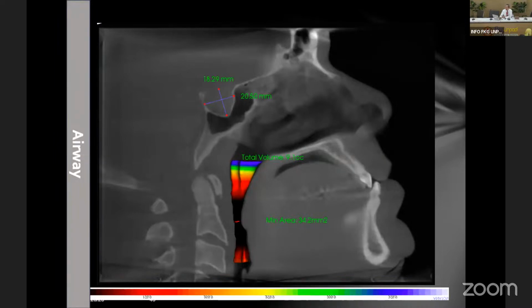This one uses Anatomage InVivo software, from the United States. We can see the minimum airway is here, right between the soft palate and the pharynx, the soft tissue. The minimum airway is 34 square millimeters here.